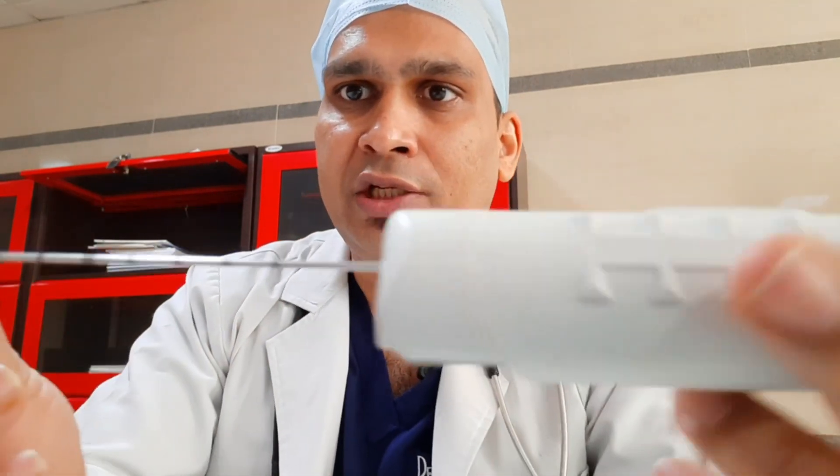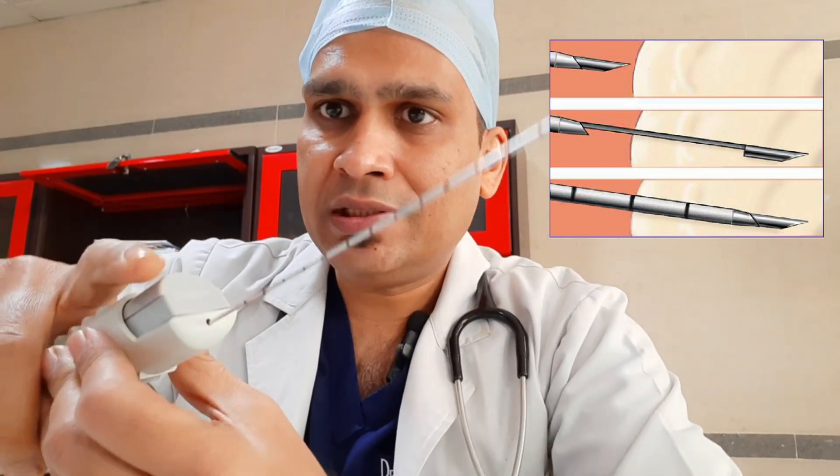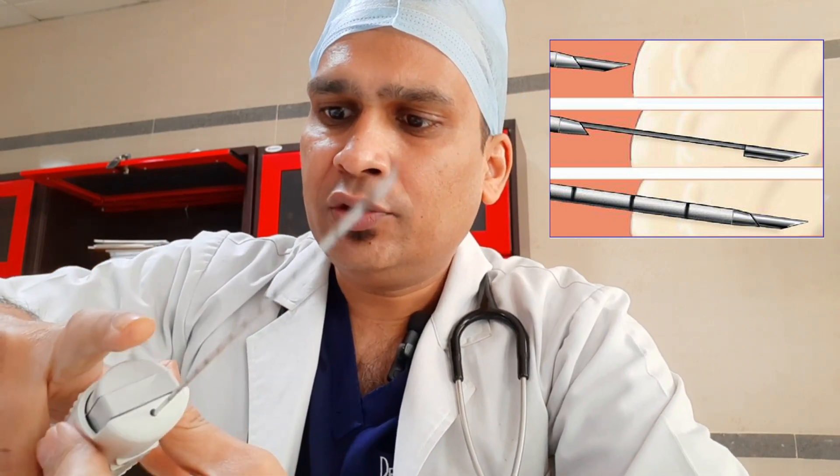This is the lever. There are two levers — this is the outer lever and this is the inner lever. This is the needle. You can see this mark — one mark is one centimeter. The needle is a combination of two needles: one is an outer hollow needle and the inner is a sharp-tipped needle.